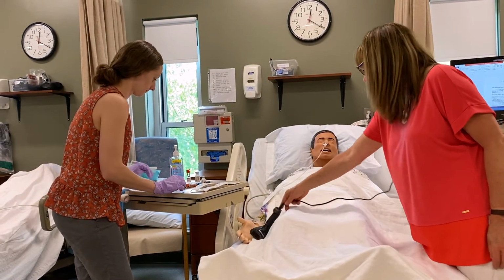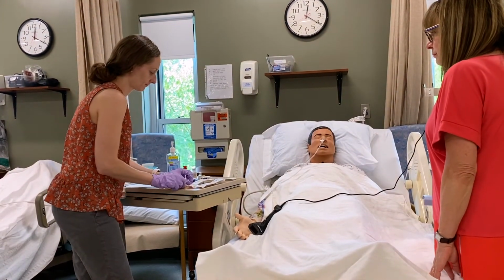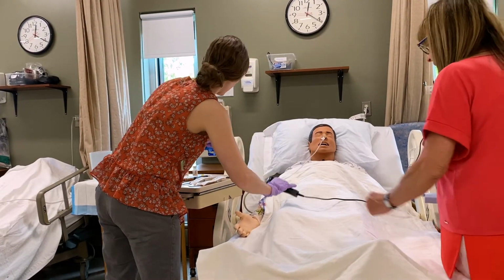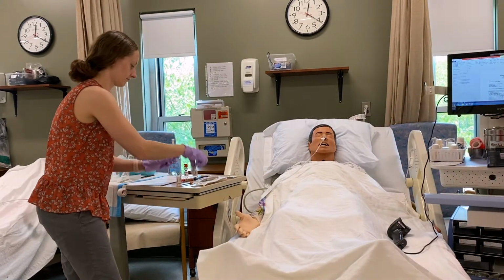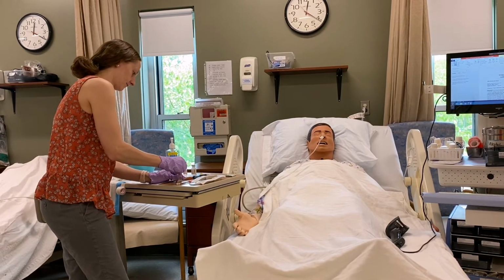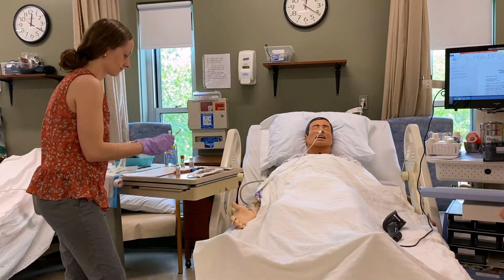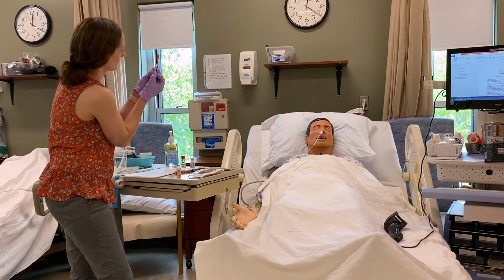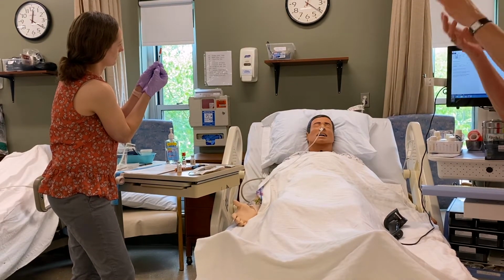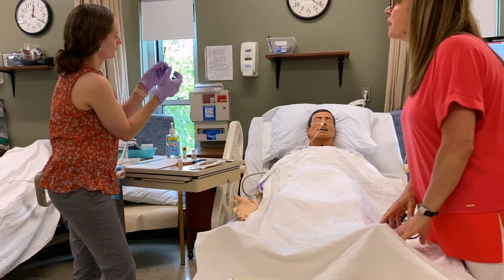Good. Great. Okay. So anytime you have a multi-purpose vial, you're going to clean the top, and you're going to always administer air into the vial, which I didn't explain. It helps to draw back your medication, creates a pressure in there without air. 8 units, great.